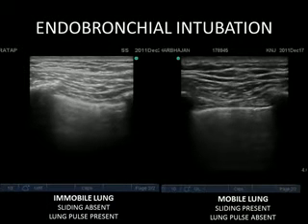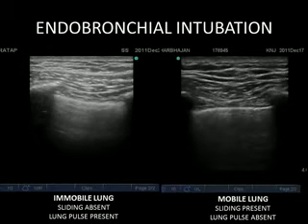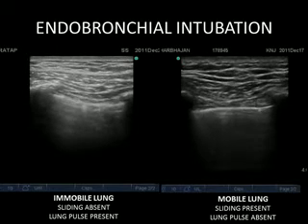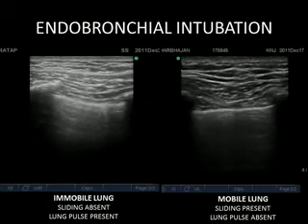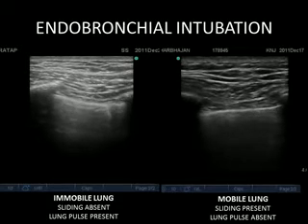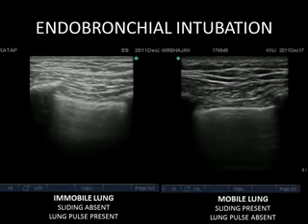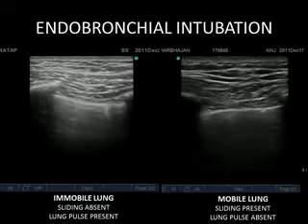Now let's discuss the sonographic presentation of a few pathological conditions. In endobronchial intubation, since the tube is only on one side, only one lung is ventilated, so there will be absence of lung movement on the affected side — the normal sliding sign will be absent and a lung pulse will be present on that side. The normal lung will have a positive sliding sign and an absence of a lung pulse.